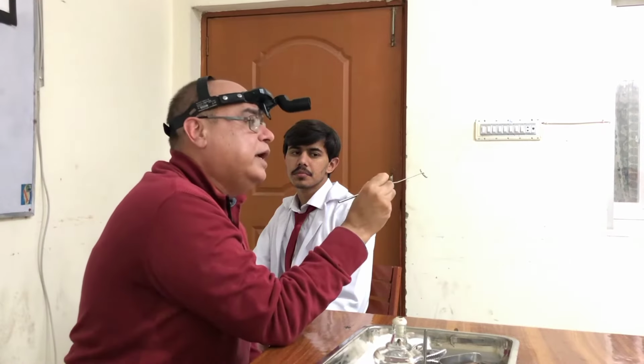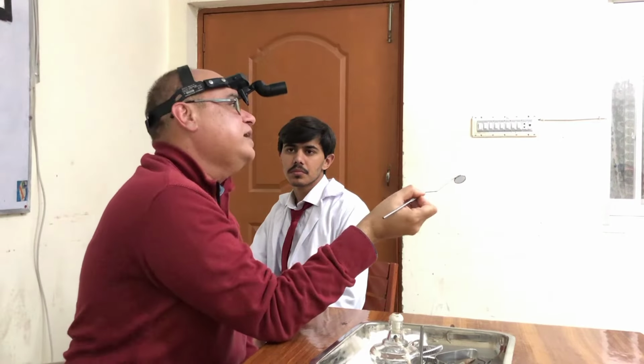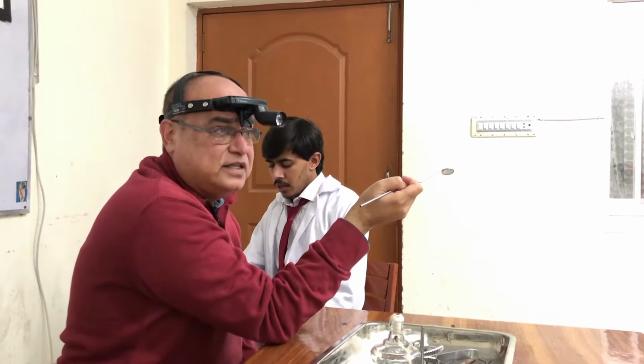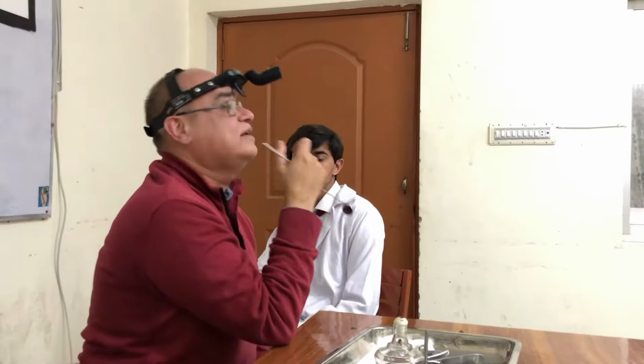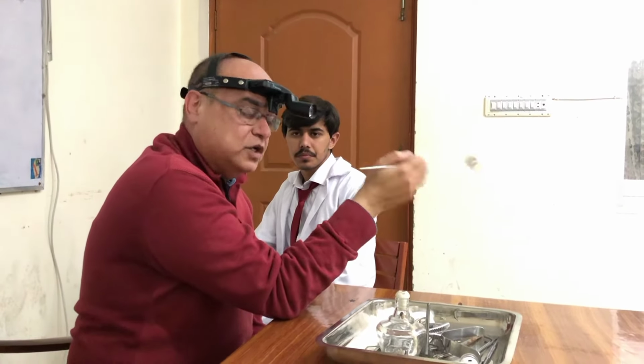As I told you, it is one of the most difficult clinical examinations, and within a few seconds you have to go far, and even then you may not be able to gather the information. That was the reason that patients were sometimes subjected to general anesthesia for nasopharyngeal examination. But now we have different tools like fiber-optic nasopharyngoscopes, CT scan and MRI. That has made our lives a bit easy. So conventionally we have to use that.